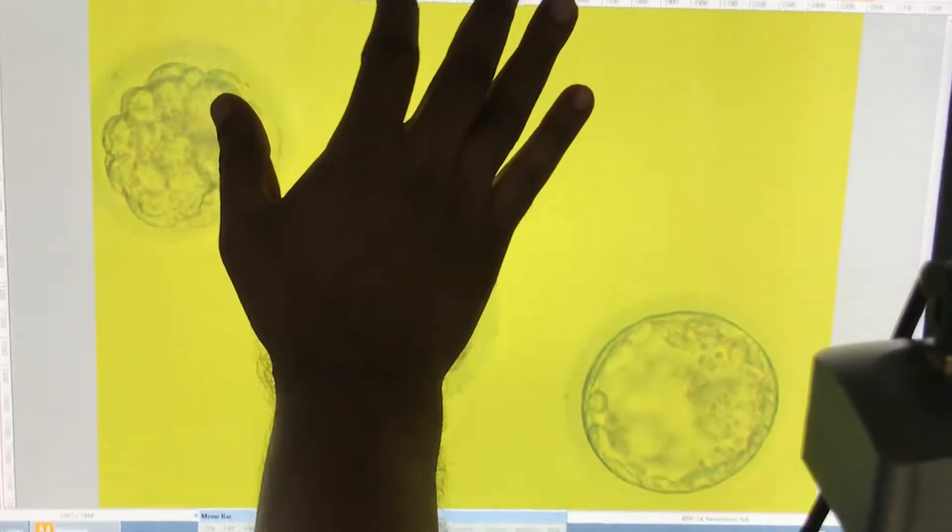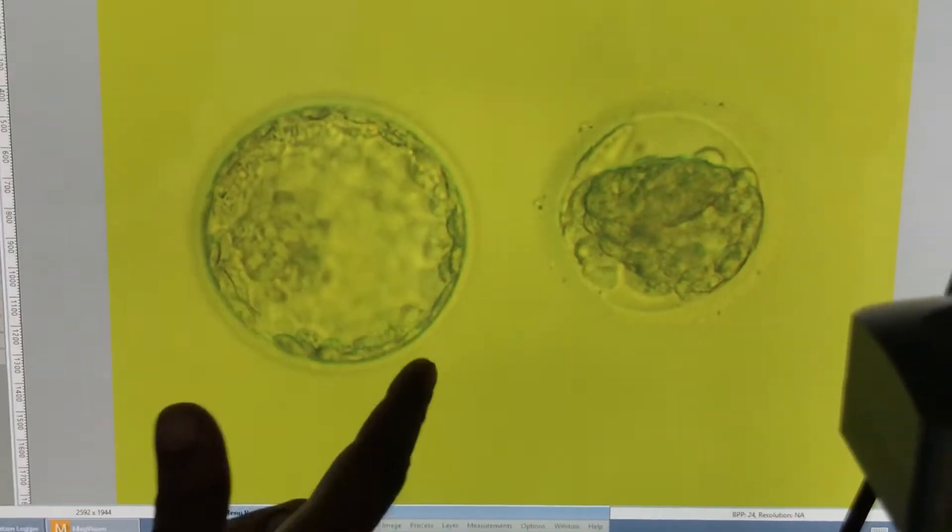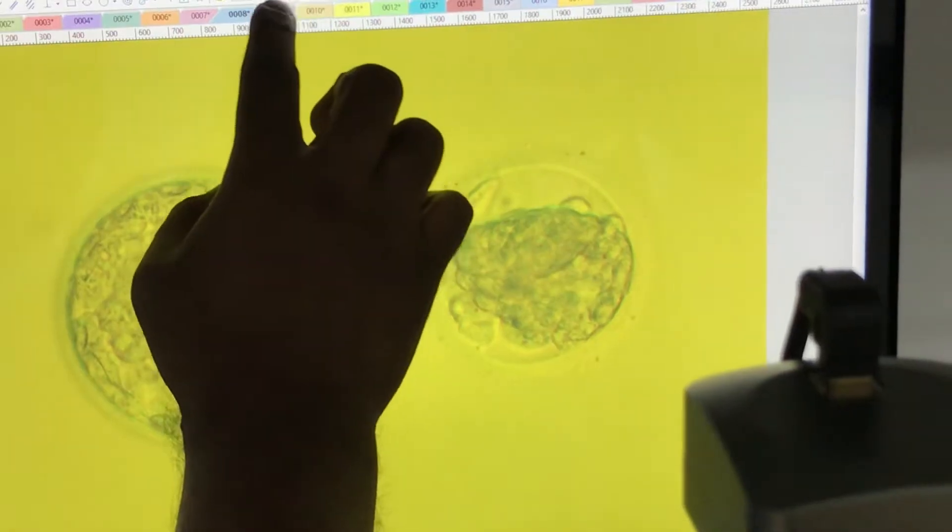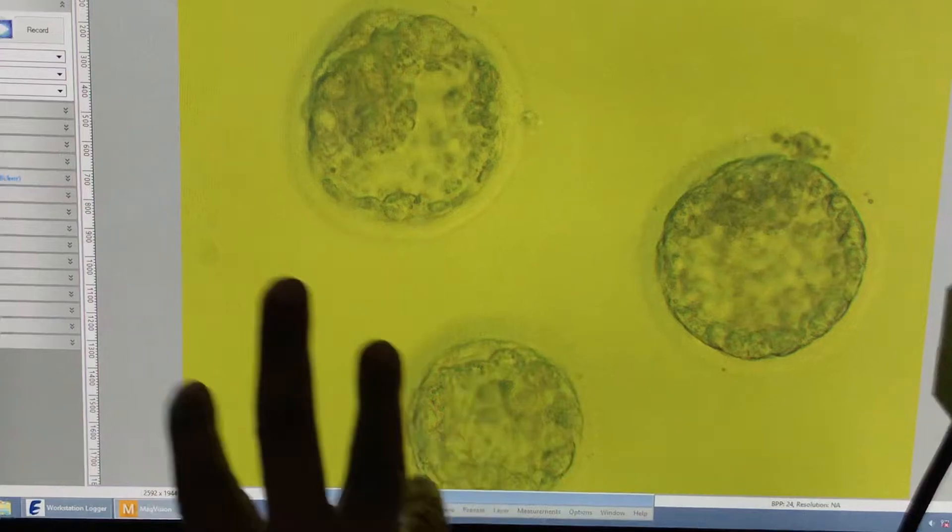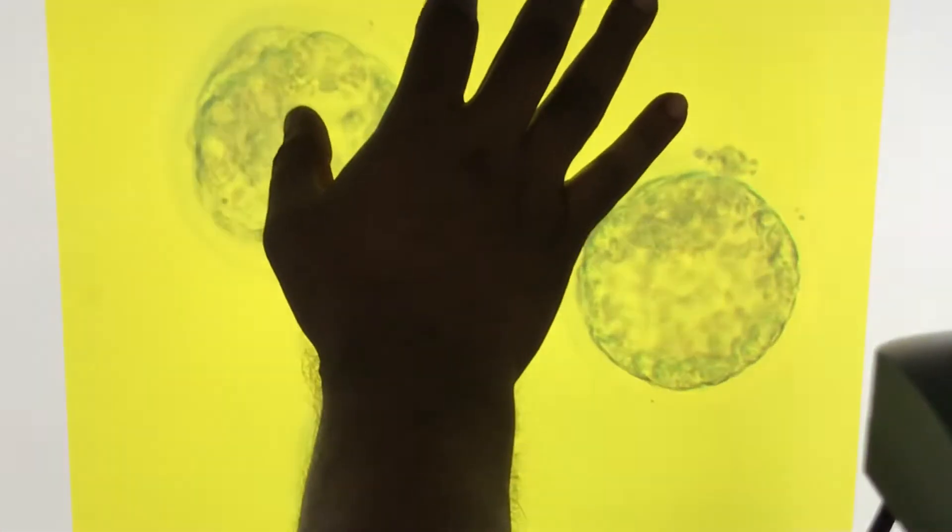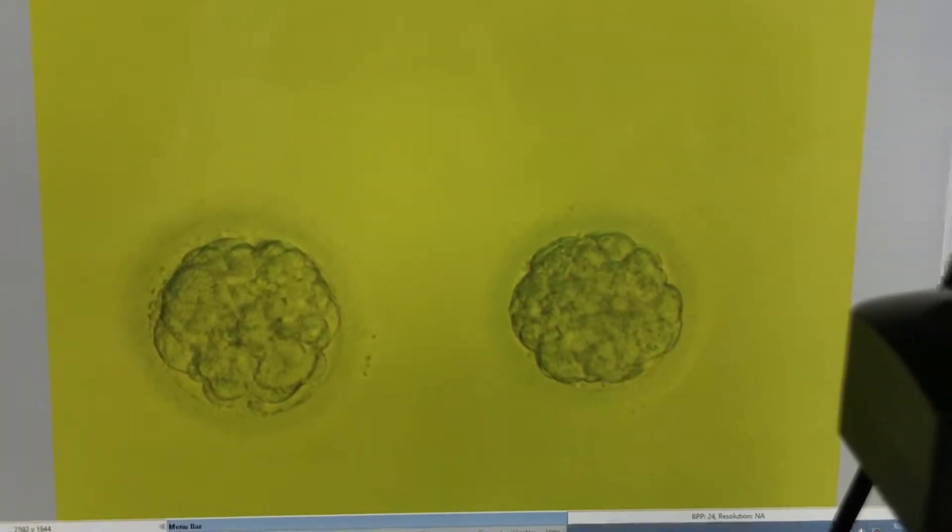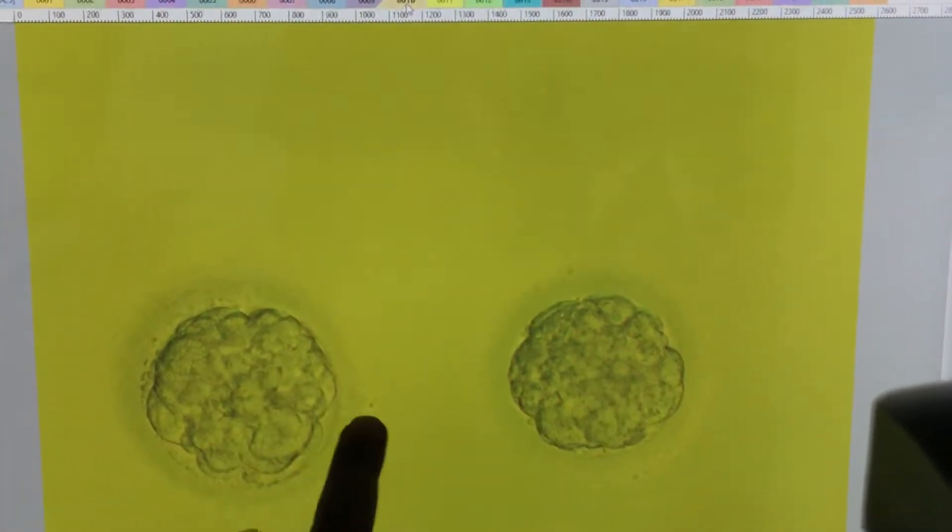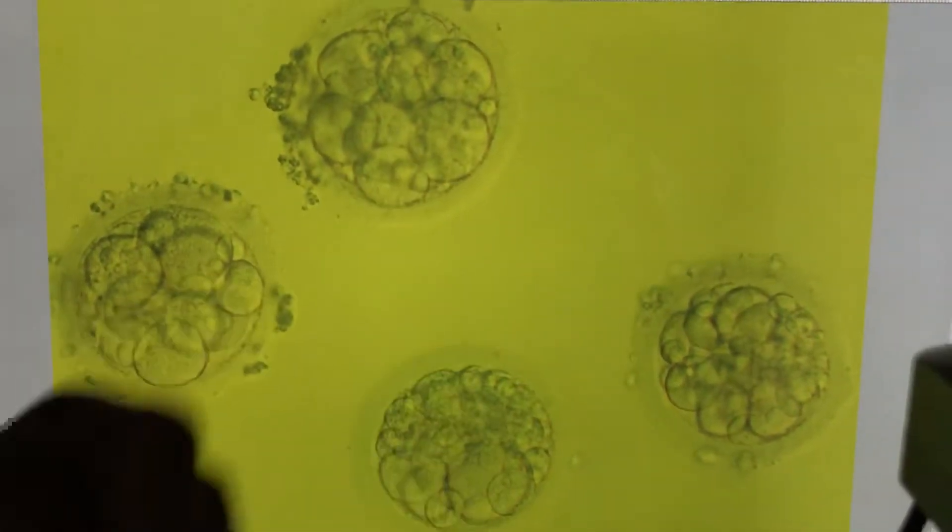Patient number seven - after thawing, this embryo is a little bit bulged. These three are good. Patient number eight has one almost about to hatch, and one 2AA something like that. We'll see the post culture. Patient number nine has cells that are a little bit scattered - we have three blastocysts post-thaw.